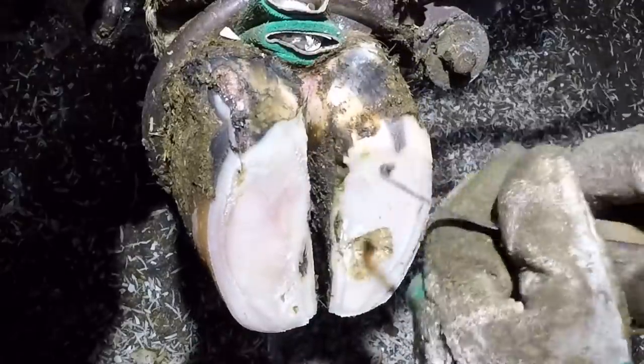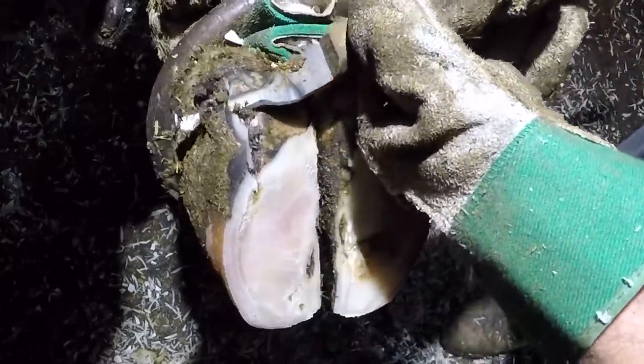The next step, now that I've got this foot shaped up, is to remove the loose hoof from around the defect itself.